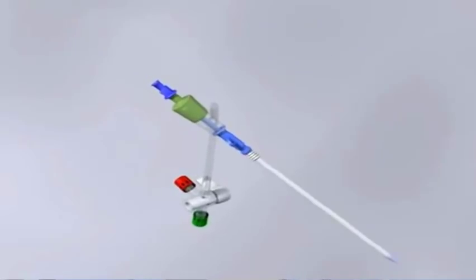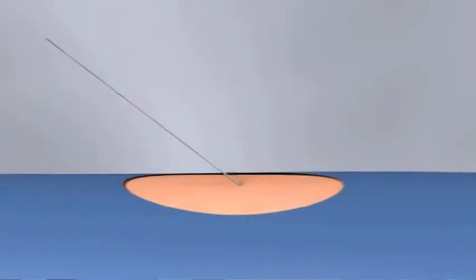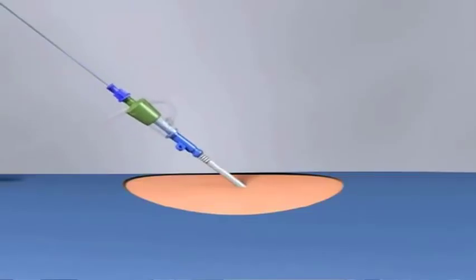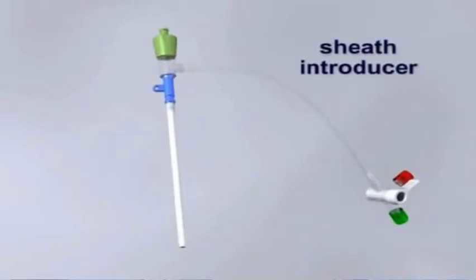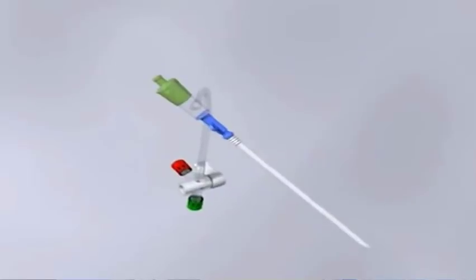And then we remove the guide wire as well as the dilator and leave the sheath there in case of pulmonary artery catheterization. So in pulmonary artery catheterization we don't use this catheter. We use a separate catheter which is called the sheath introducer.